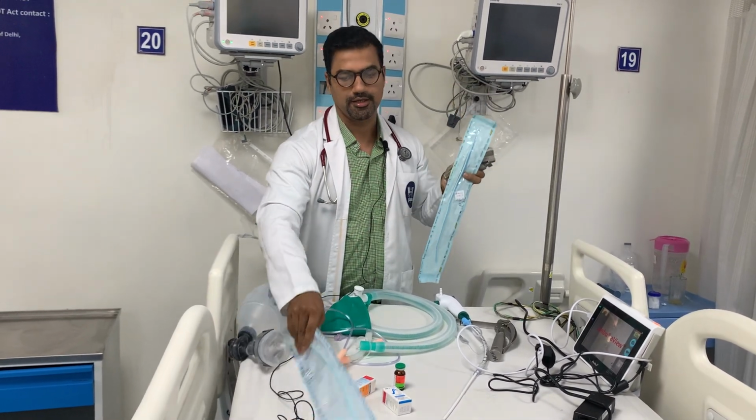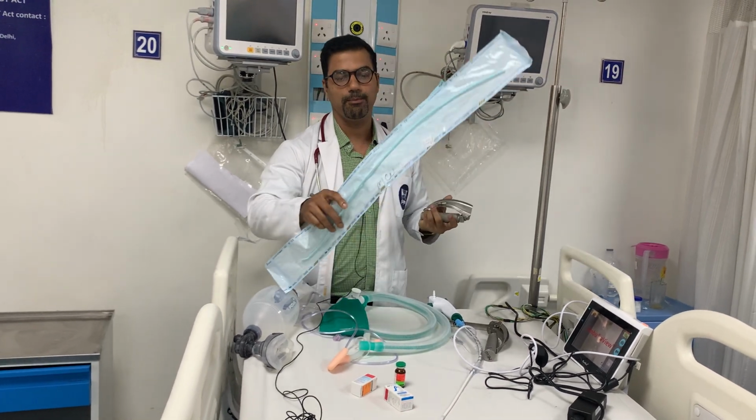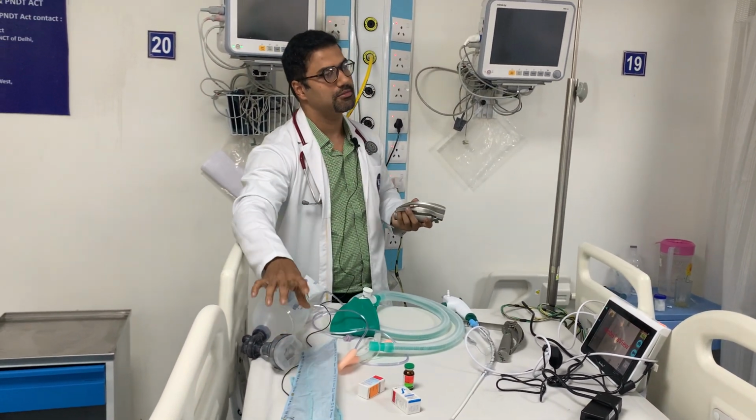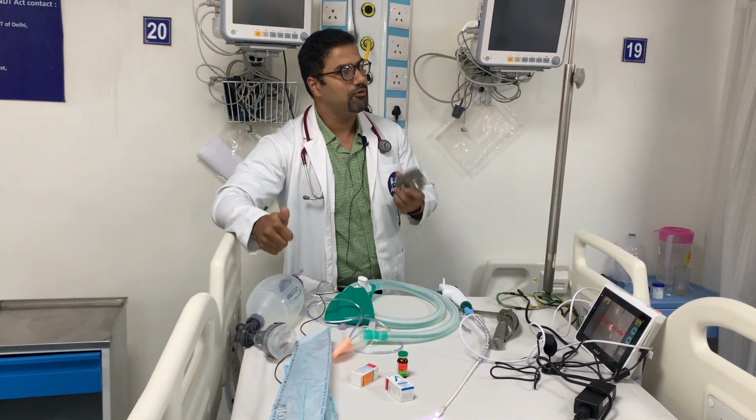Sorry, this is a stylet, and then this is the bougie, the longer one. These two things are mandatory whenever you are intubating a patient. Now coming back to the patient, you have used the monitor, you have used the IV lines.